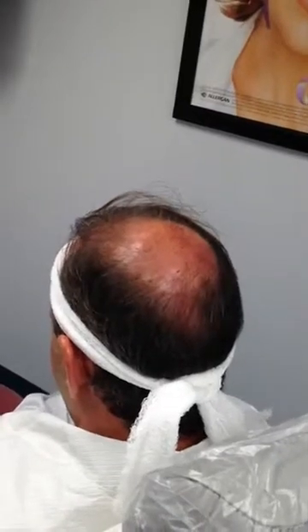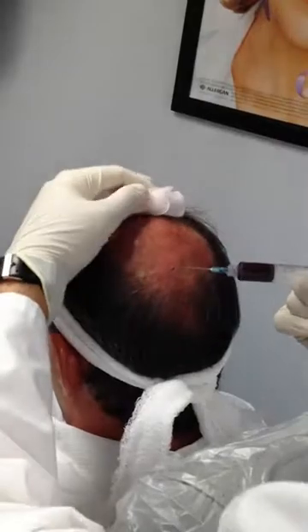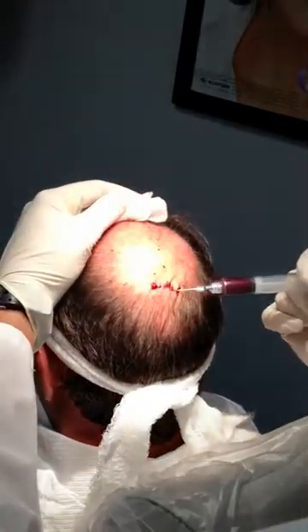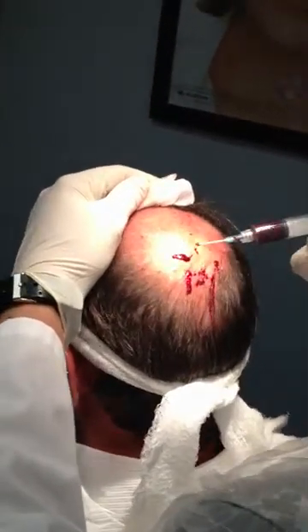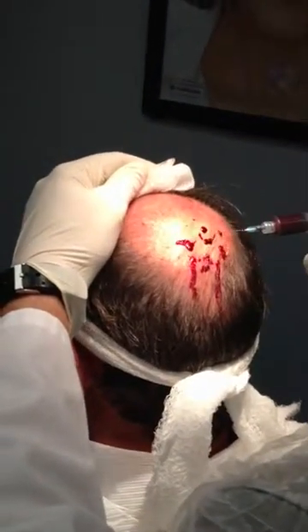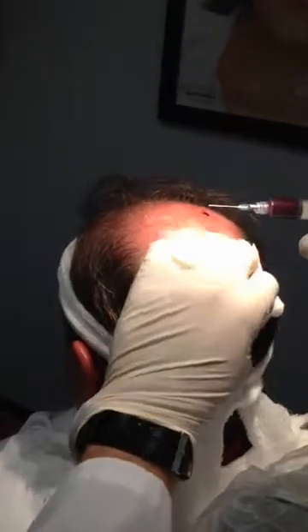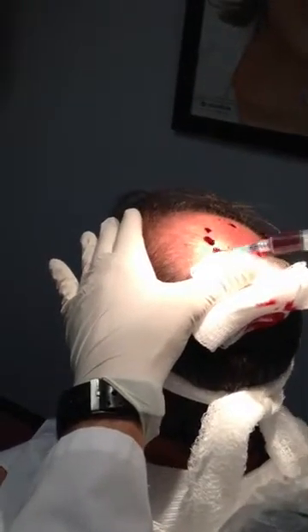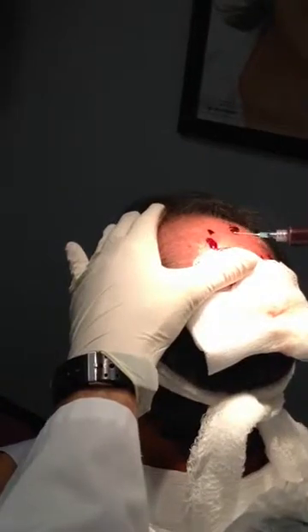This should take a few seconds. Petro waited about a half hour after we drew his blood. We spun the blood down in a centrifuge, which took about a half hour. And now this is the time it takes to inject. Are you doing okay, Petro? You felt a little bit there — we can touch that up.